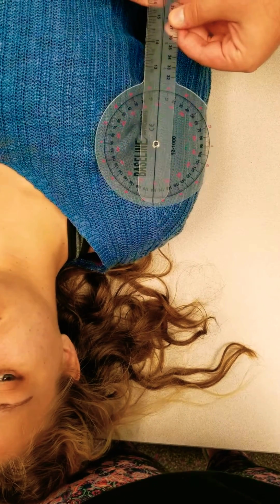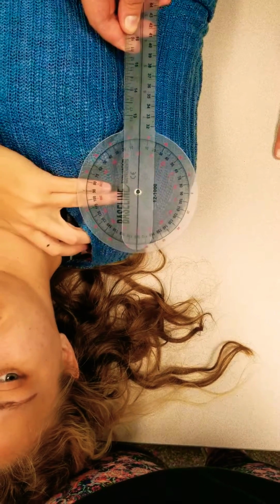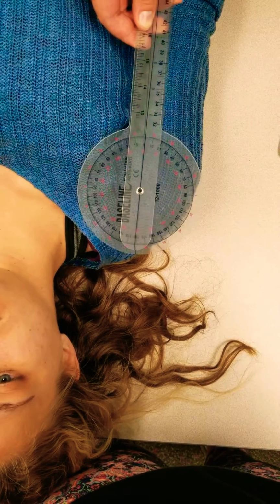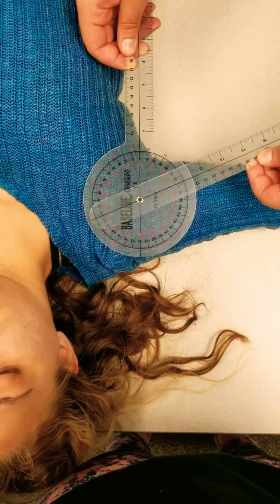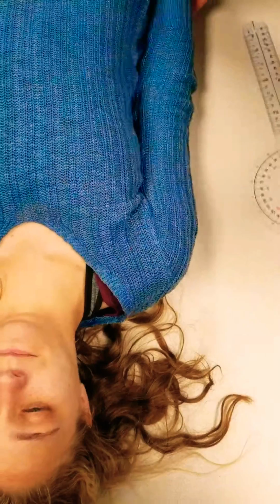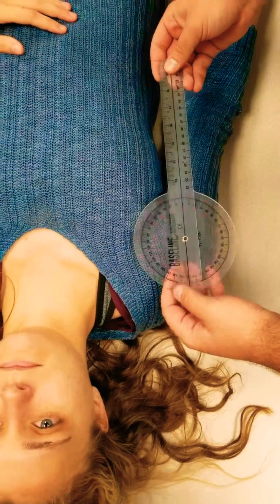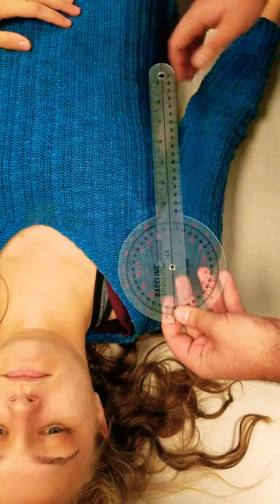The landmarks that we are using: for the center, the anterior aspect of the acromial process. The stationary arm is going to be on the midline of the anterior aspect of the sternum. The movement arm will be on the medial epicondyle of the humerus. The first range of motion we are going to study is active. The next range of motion that we're going to study for abduction is passive range of motion.